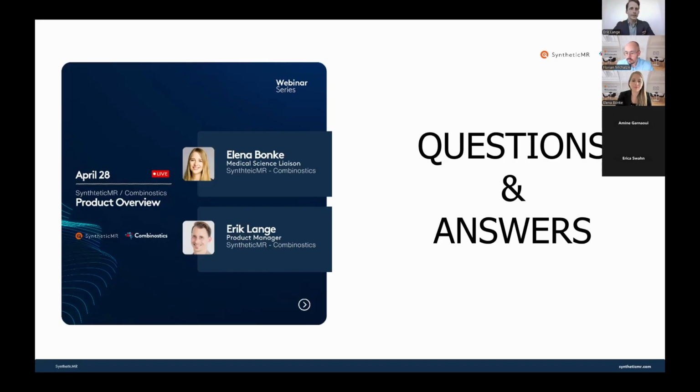Absolutely. So a typical setup with SyMRI involves multiple protocols, and you can absolutely set up rules in SyConnect on what kind of outputs you want to provide. So for example, in MS patients, we may want to have the T1, T2, double inversion and phase-sensitive inversion, but we might not care for the CSF map, for example.